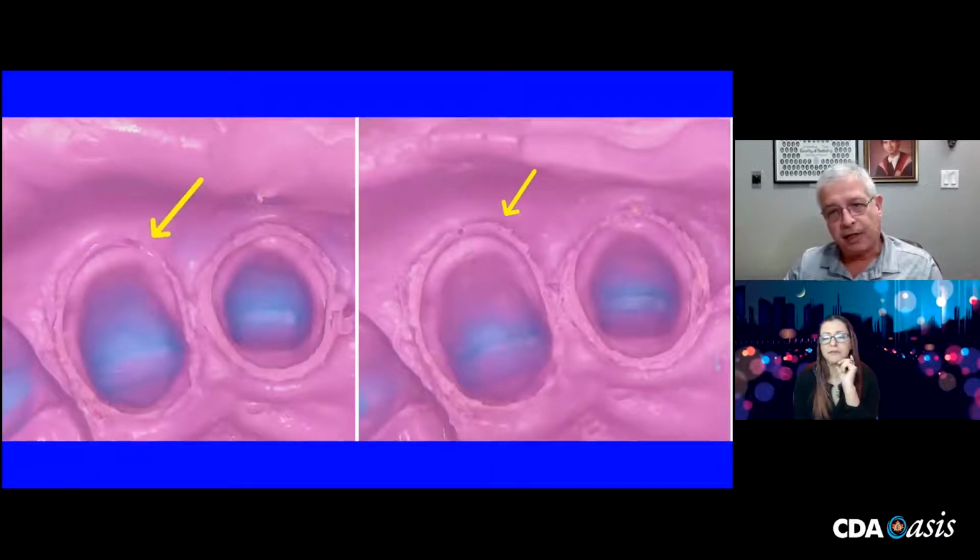So recognizing I'm fallible, on these cases where there are multiple abutments, you can miss something somewhere. Now, I can only address impressions such as I'm taking them. I can't talk about digital.